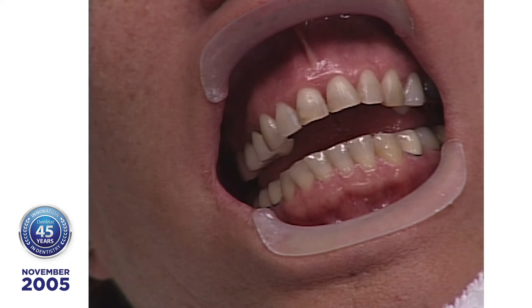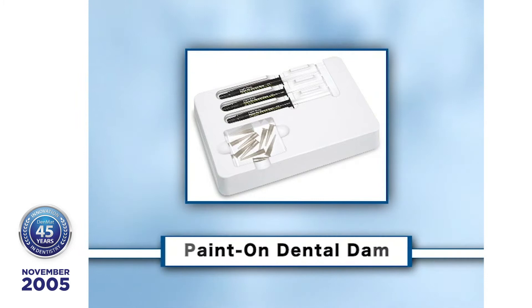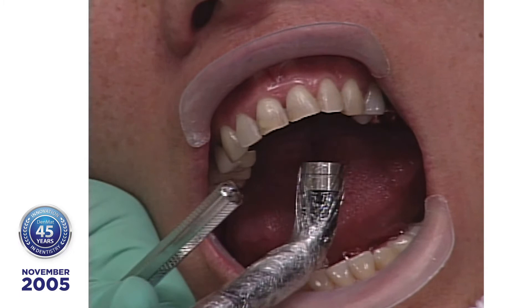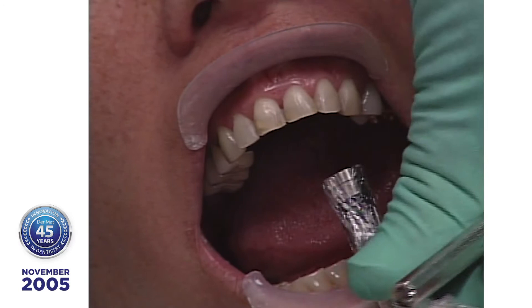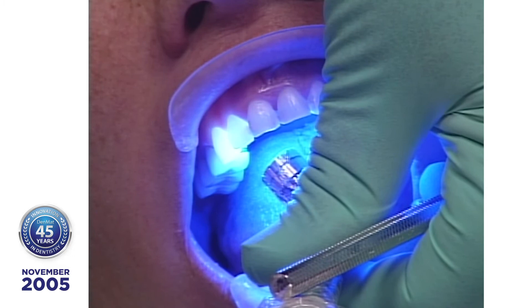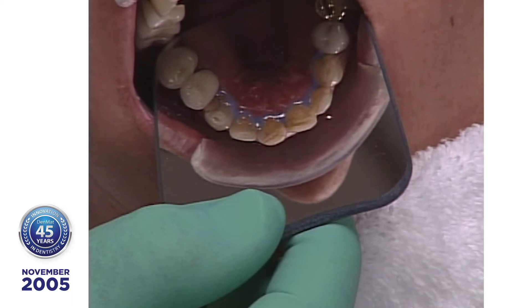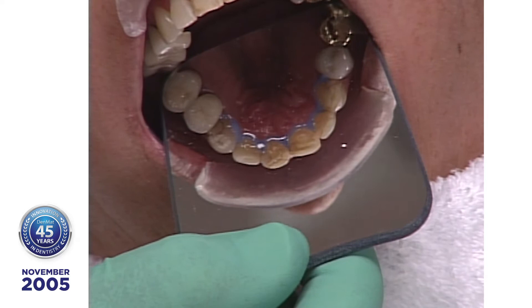Now I'm placing a little paint-on dental dam on the lingual side of the teeth. We're going to cure that paint-on dental dam at about an inch away — close your eyes. Now let's take a look at what we just did. See that blue on the interproximal and the gingival embrasures? Wherever that blue is, the ultrabond won't be able to go into that area. So when we get finished placing the lumineers, we can tell where the blue is — it's much easier to take out.